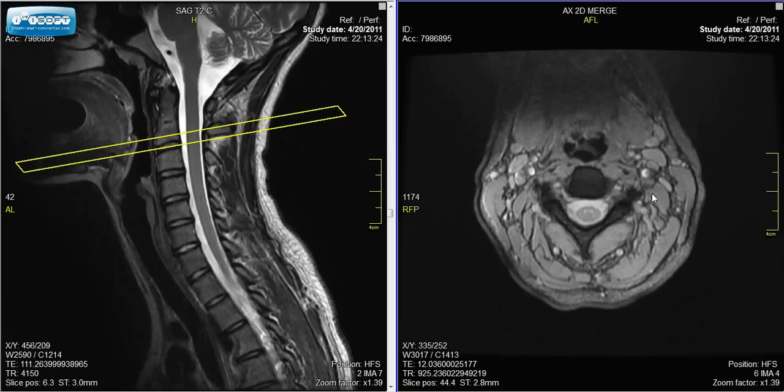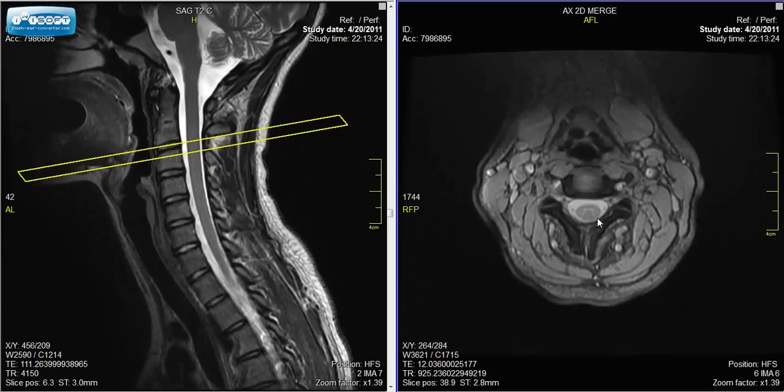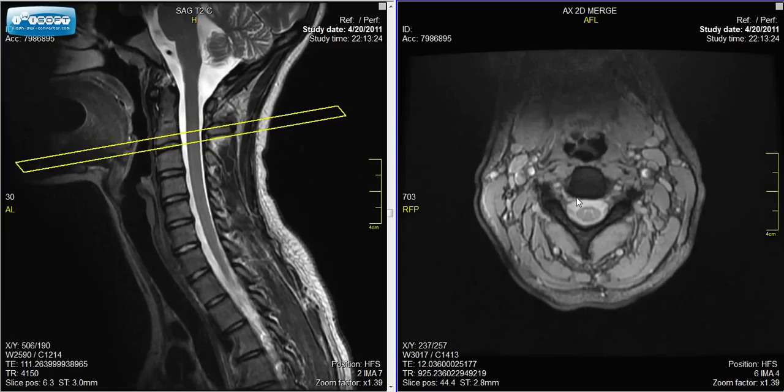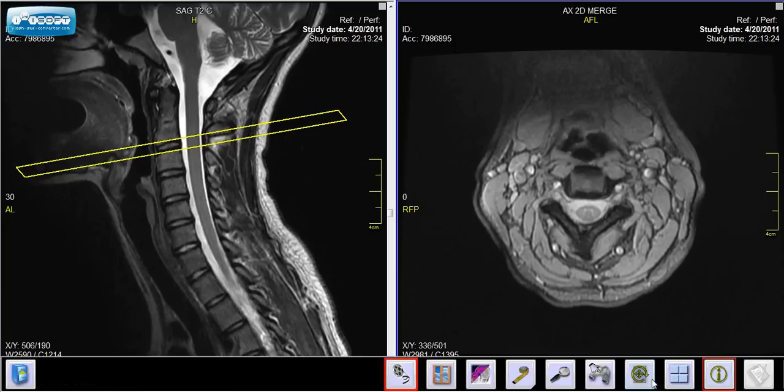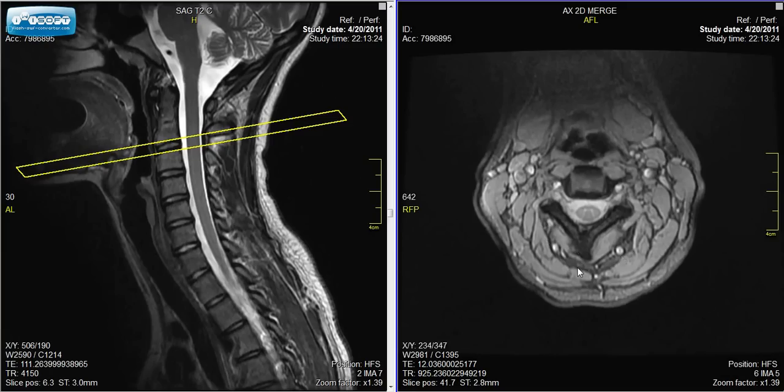On the right are the axial, or cross-section, views — a series of slices in the horizontal direction. The level is shown by the yellow lines on the sagittal view. Each picture is oriented as if the person is lying on their back and we are looking up from the direction of the feet. So this is the back of the neck, front, right side, and left side. These are the neck muscles.